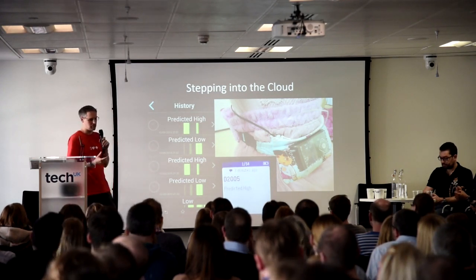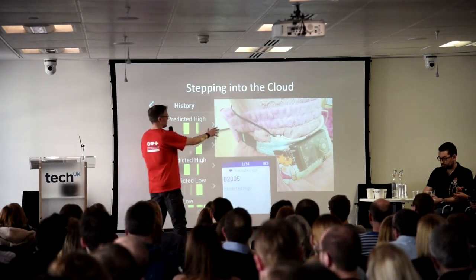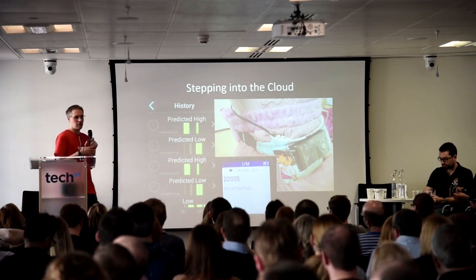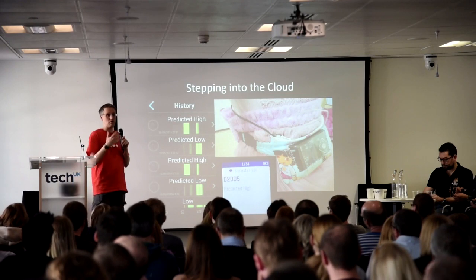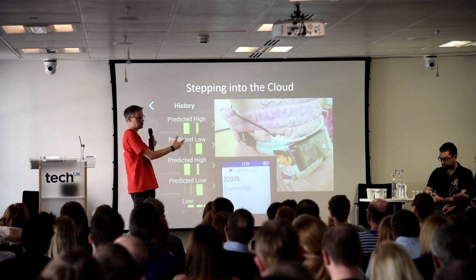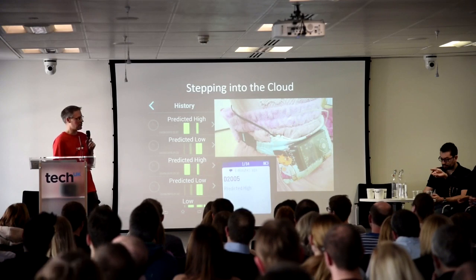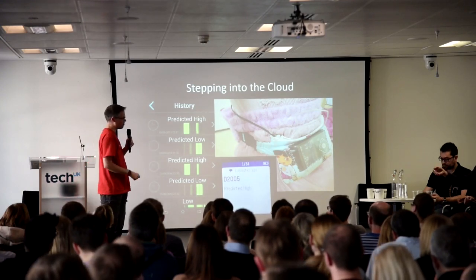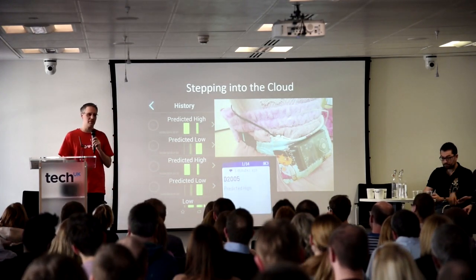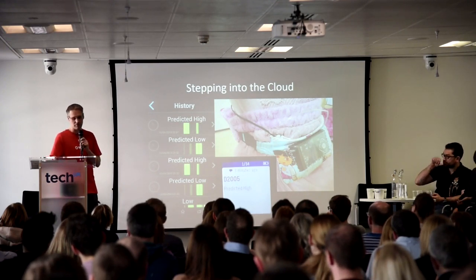So the first thing I did was to put a small microphone into the pump pouch, routed round to a small Android phone that sat around the back here. We run an app called OtterSense, which was designed for people who can't hear to know that there's a smoke alarm or a fire alarm going off, for example. And basically I trained that app to pick up not just that the pump is alarming, but what type of alarm it is. The Medtronic does give slightly different alarm tones, and we were able to push that up to the cloud, and I get a remote alarm on my wrist to say the pump had alarmed, and that was the second alarm, third alarm, and so on.